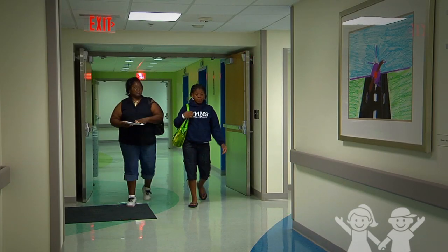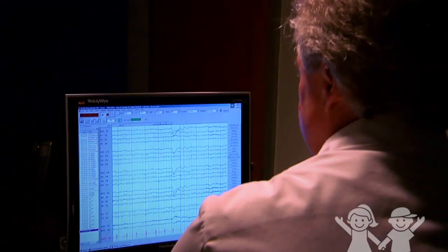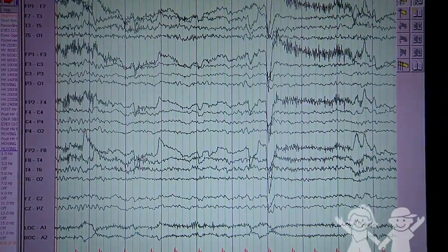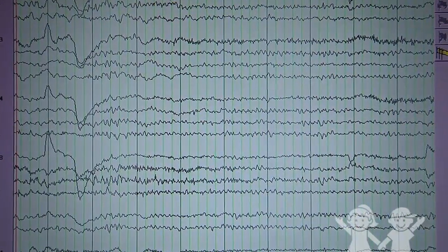You are here to have an electroencephalogram called an EEG, or video electroencephalogram called a VEEG. An EEG is a test that uses special sensors placed all over the head that measure the electrical signals your brain sends out. Those signals are recorded so the doctor can see them.